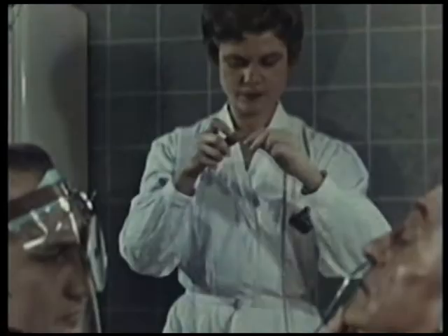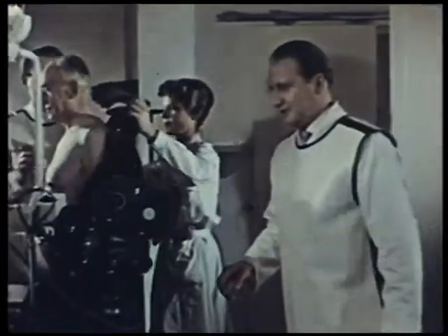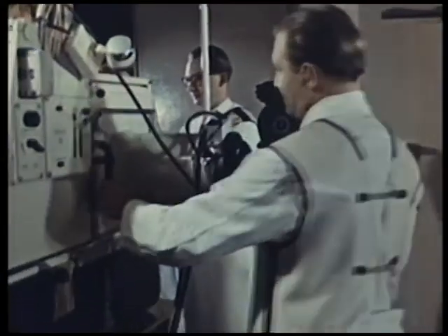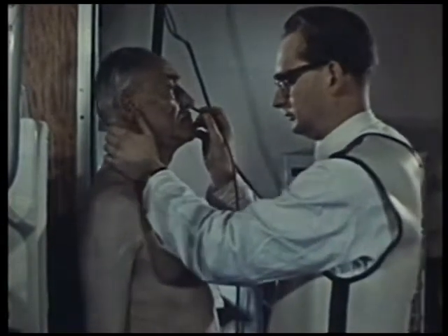After these preliminary measures, the examination proper begins. The catheter is introduced into the nose.